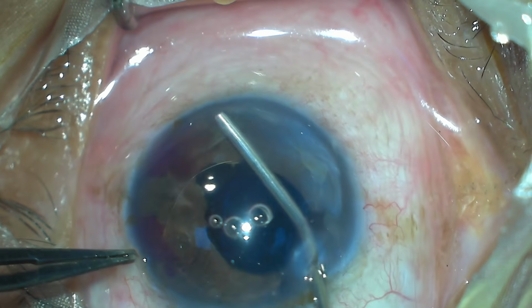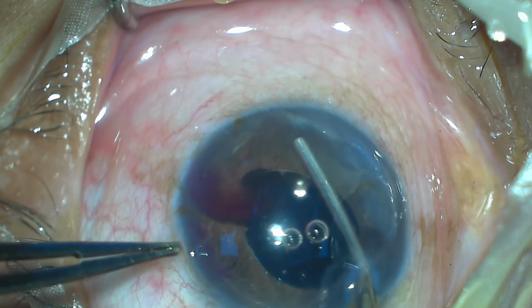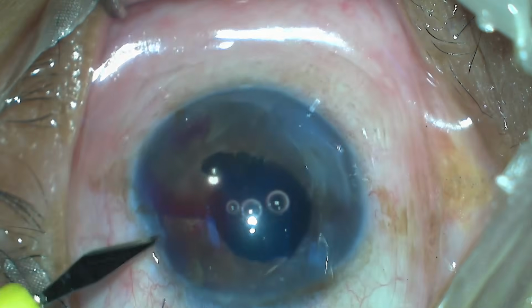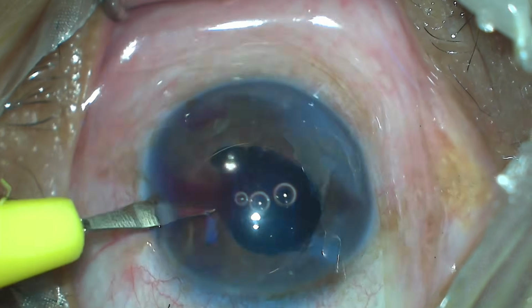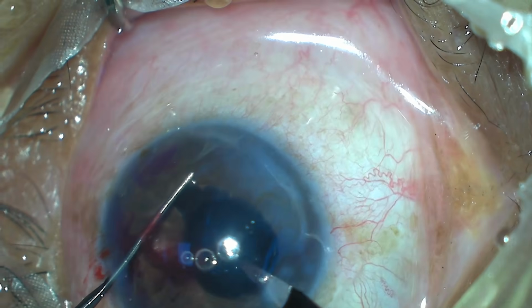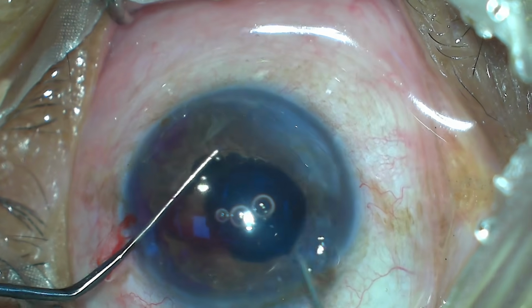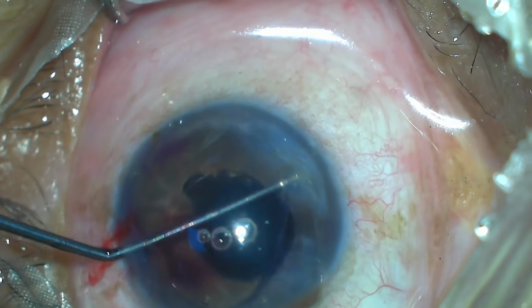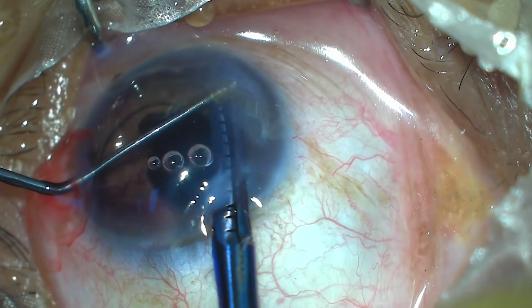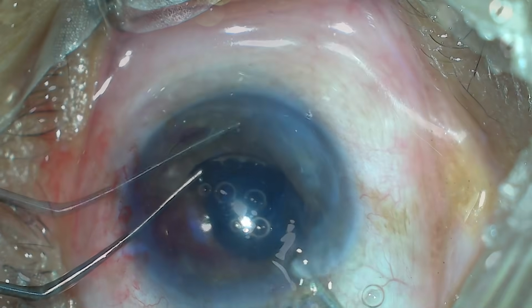At this moment, I planned to cut the inferior haptic from the optic with an IOL cutting scissors. Another side port was made at 2 o'clock position and the previous one was enlarged. Viscoelastic was injected, stabilizing the inferior haptic with the dialer. The cutter was used to cut the haptic at the haptic-optic junction, and the optic was successfully separated.